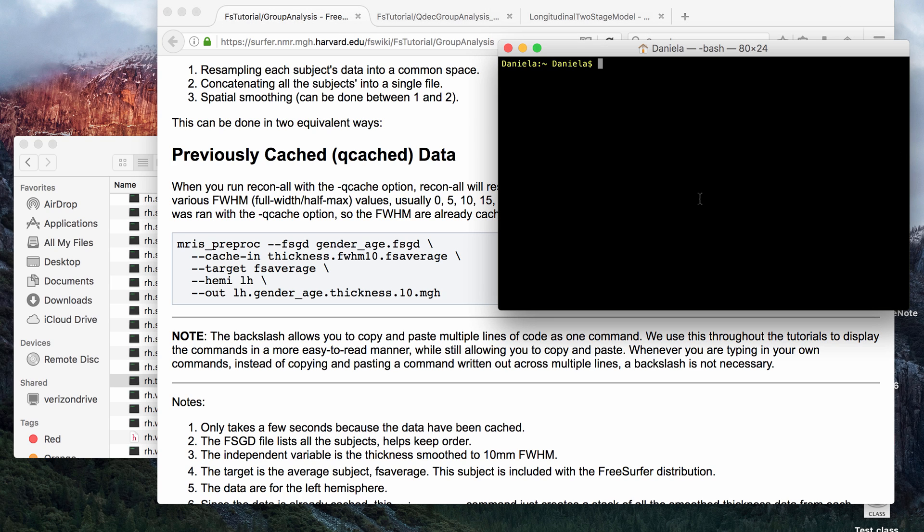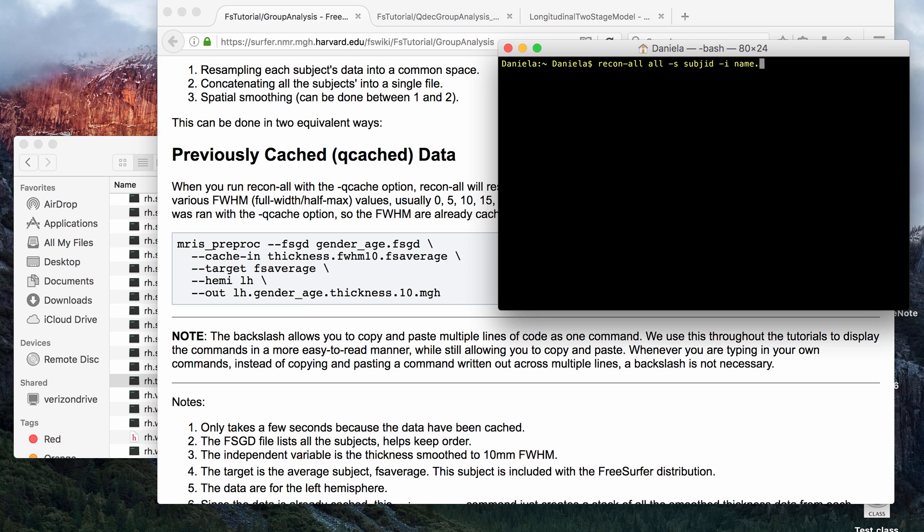There are two ways of running Qcache. If you haven't processed your subject but you have the nifty or the dicoms, then you can go ahead and do recon-all with your subject ID and input the name of the nifty and then just add Qcache at the end and that will run the Qcache command.